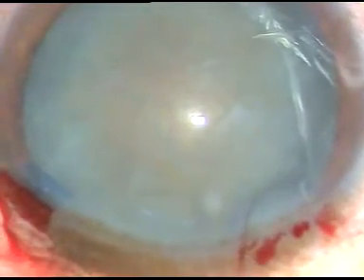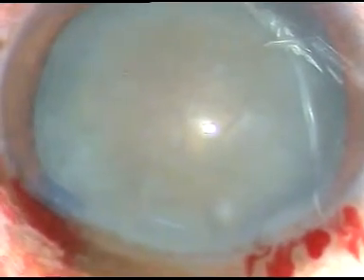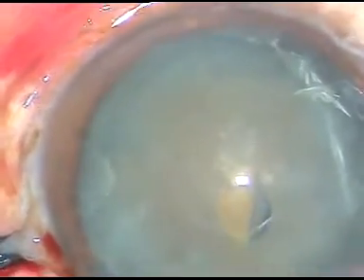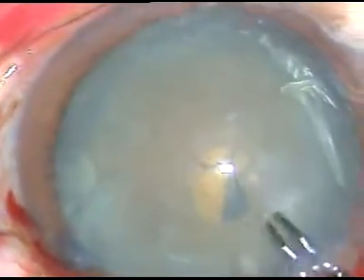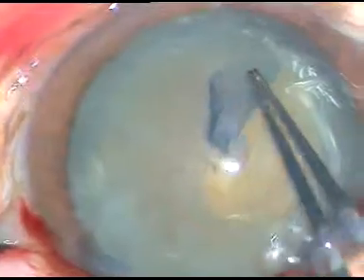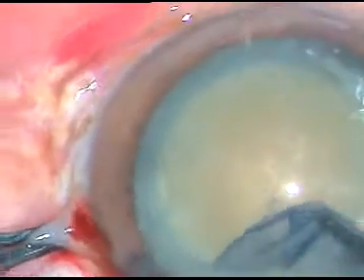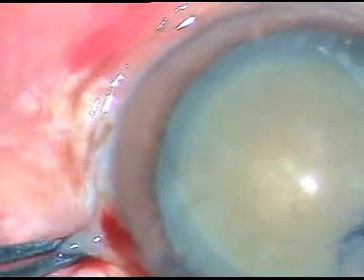This is the first case. I have done the main incision and a paracentesis incision on the left side of the main incision. Now capsular rhexis is being done. A capsular tag has been raised by a 26-gauge bent needle. I hold this tag with utrata forceps, go anti-clockwise, and try to stay at equal distance from the margin of the dilated pupil, thus getting a reasonably good rhexis.